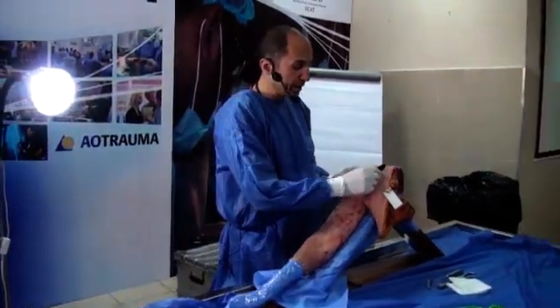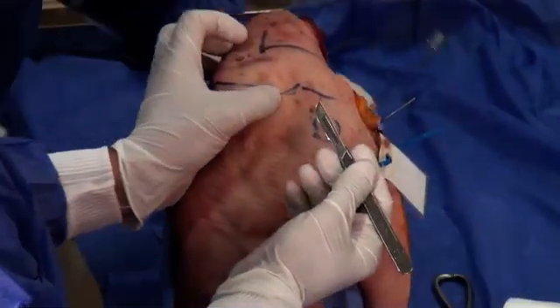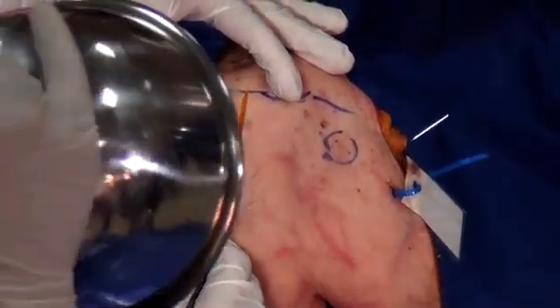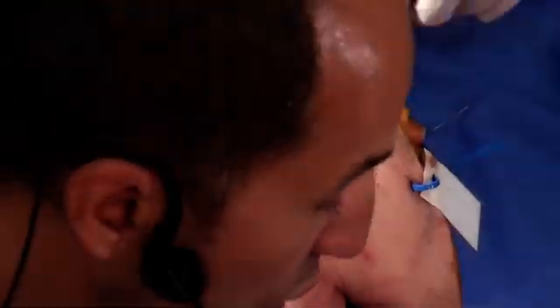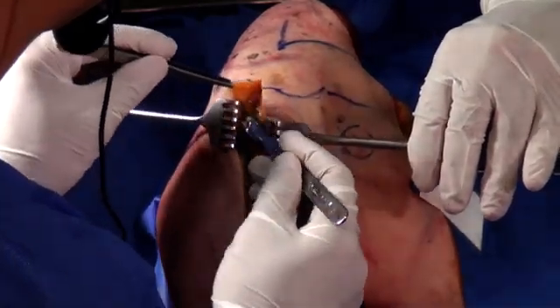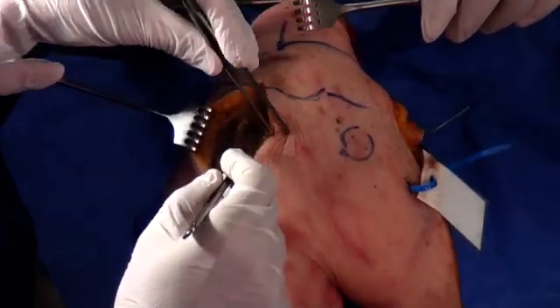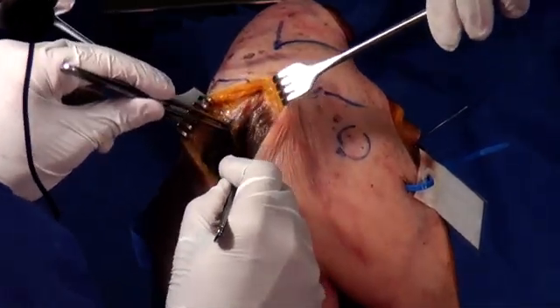We'll mark the acromion, the clavicle, and the coracoid process. If we go between the anterior and middle heads of the deltoid, we will go along the anterior acromion. We're going to be a little more lateral, splitting a small part of the deltoid. We'll do bigger incisions here because you want to be comfortable — in real life, you can always go smaller. A little bit of dissection, then we'll go through the deltoid fibers.